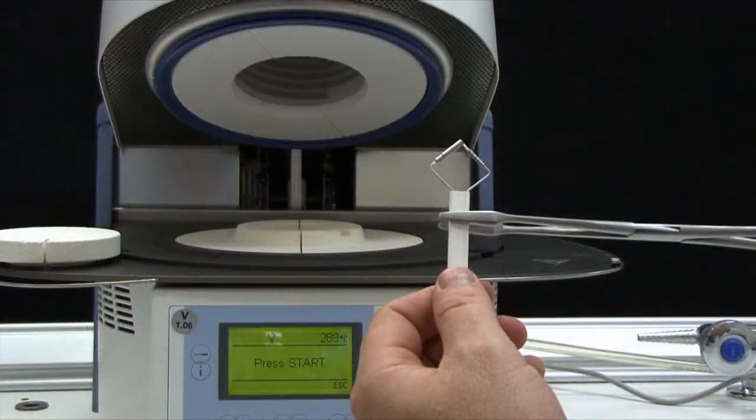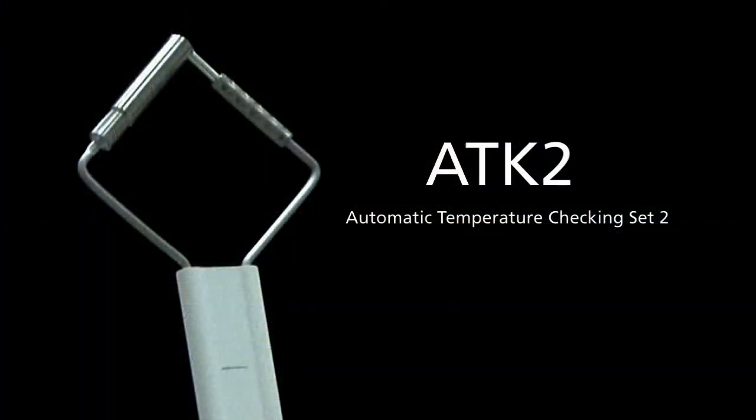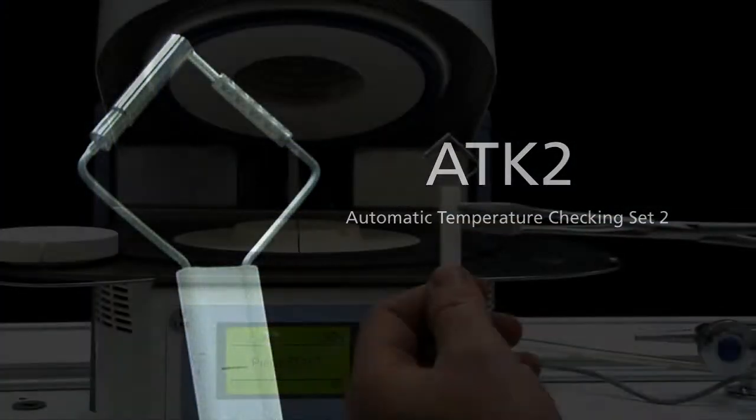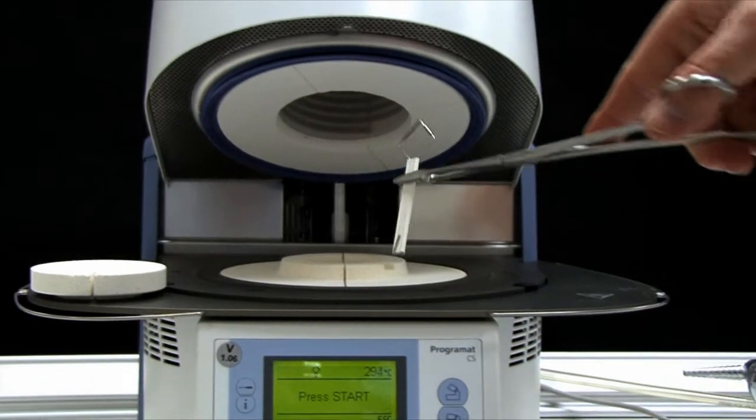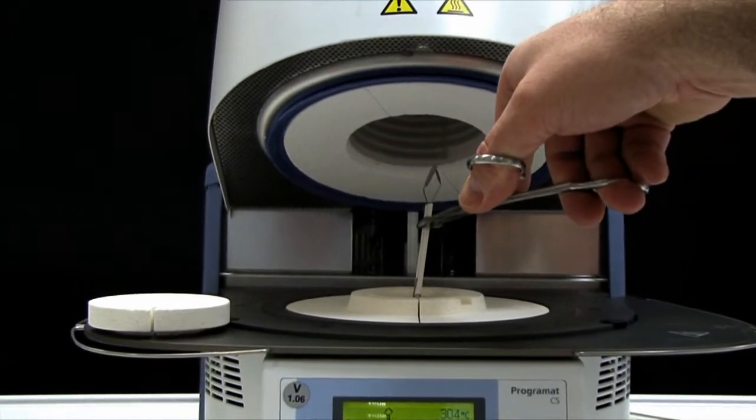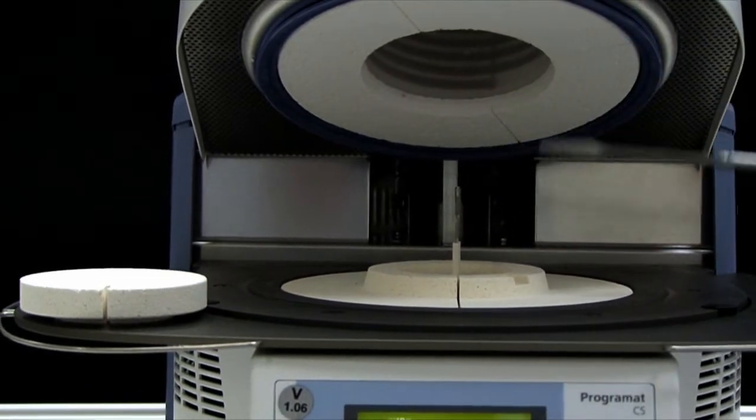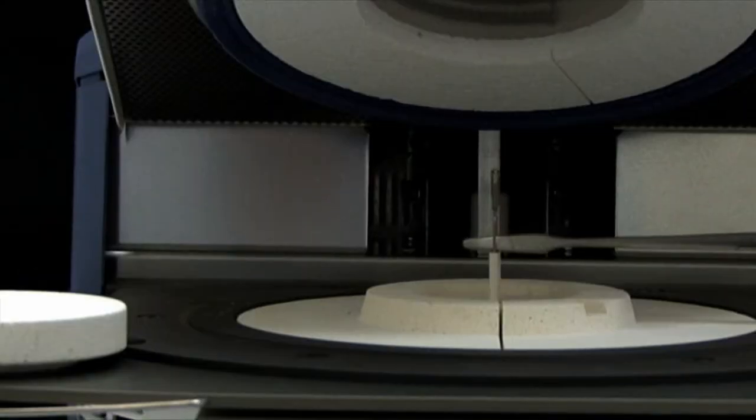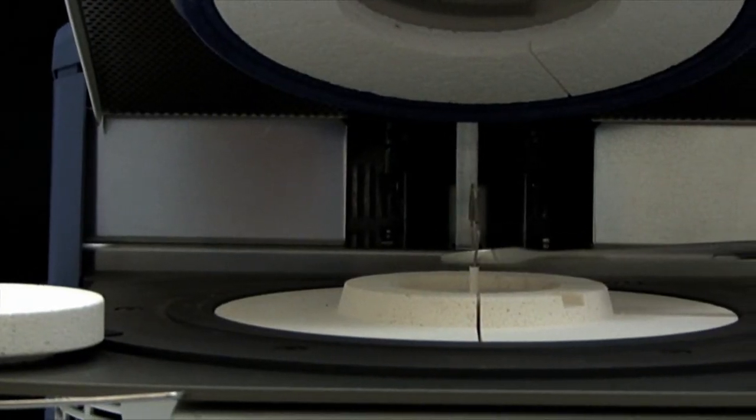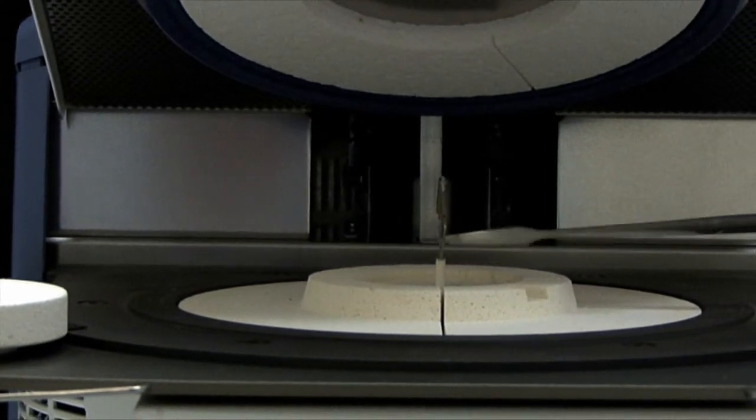Carefully grip the upper part of the Automatic Temperature Checking Set 2, otherwise known as the ATK2, with the furnace tongs and insert it into the hole until it snaps into place. If necessary, use the furnace tongs to apply slight pressure to the center of the ATK2 base until the sample clicks into place.